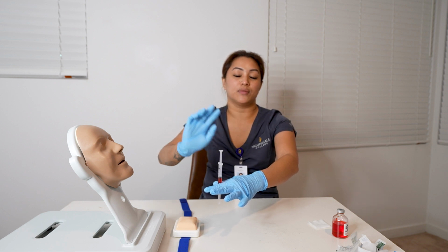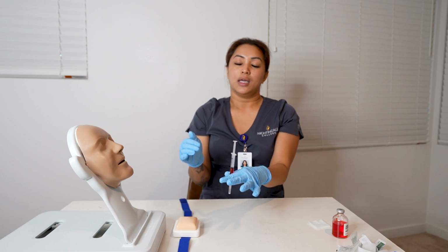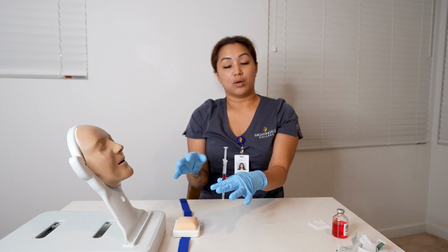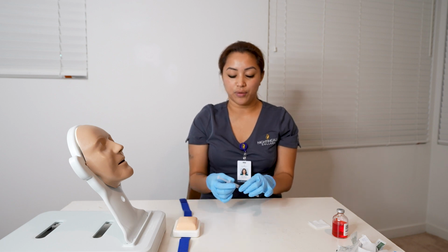And then once everything is injected, we have to wait 10 seconds just to make sure that the deltoid muscle has absorbed the medication. All right, perfect. So now that it is air dried, everything looks perfect.